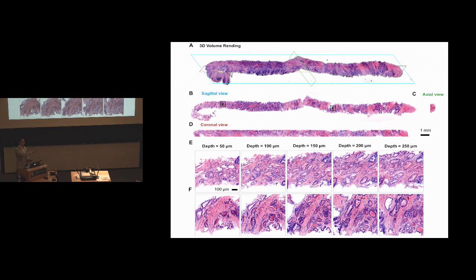We could tell them we're comprehensively imaging the surface, which is different from pathology. With pathology, they usually cut vertical sections at different locations at the margin, so they're not comprehensively imaging the whole surface. So actually, I think this is a better approach for imaging the surface for looking at tumor on ink.